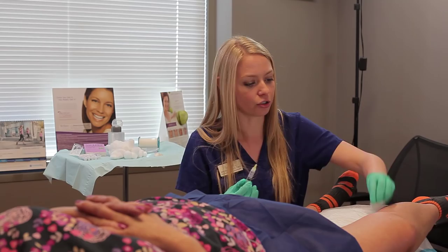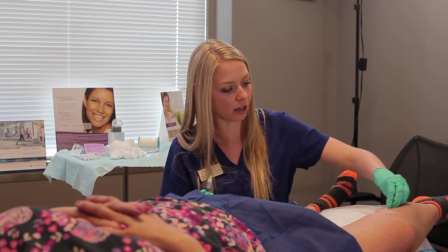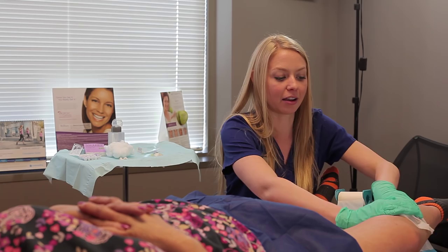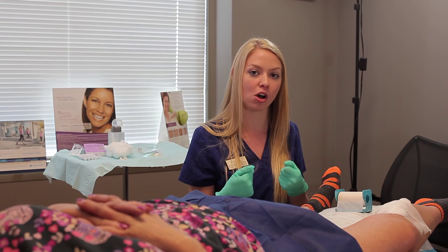We're just coming to the end of the treatment here — pretty much got everything that bothers Frances. After we finish the sclerotherapy, we get cotton balls and tape on the area. What this does is help add extra compression. So when Frances goes to put her compression stockings on, those main areas that we treated just have a little bit of added extra pressure.